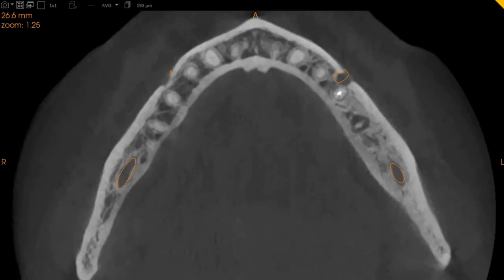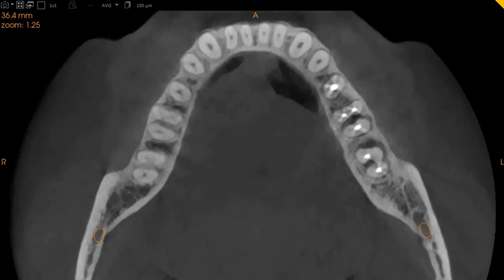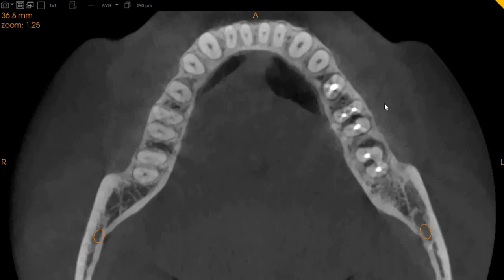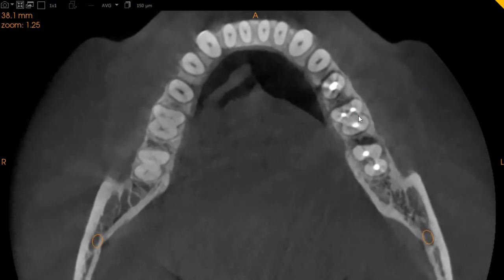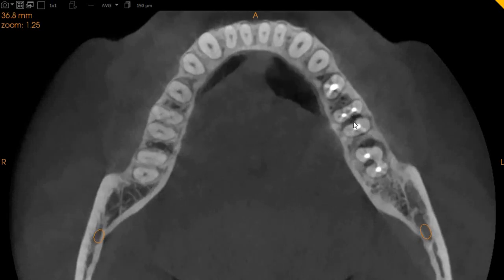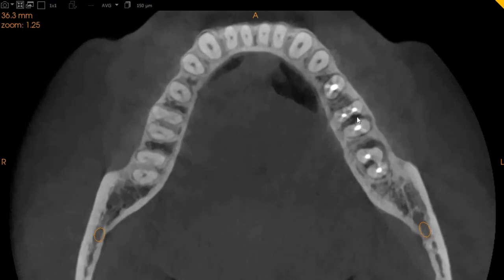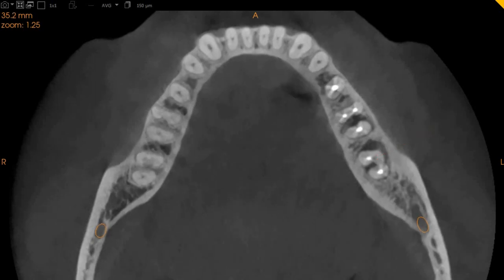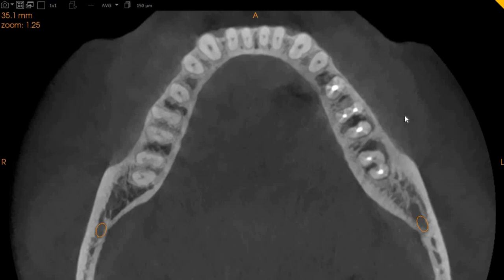The axial view, which is the top to bottom view, allows you to appreciate the furcation area where we believe there is a crack. You can also see it on the axial view — this is where the radiolucency in the furcation area begins. Here is that missed canal in the lower left 7. Very clearly, you can see this is a missed canal, and it is also associated with the infection in the bone.